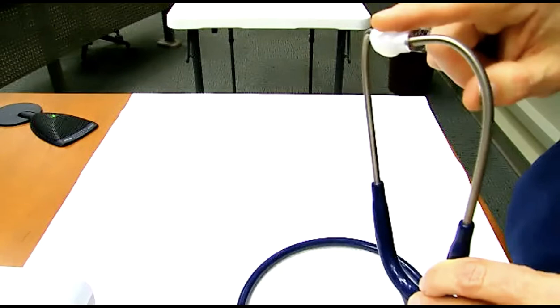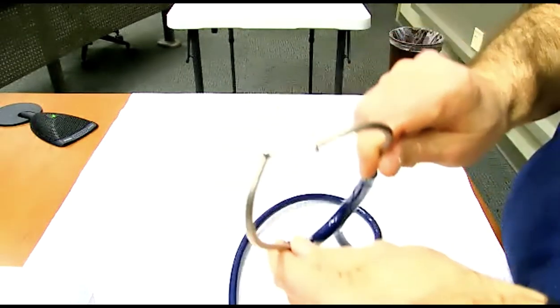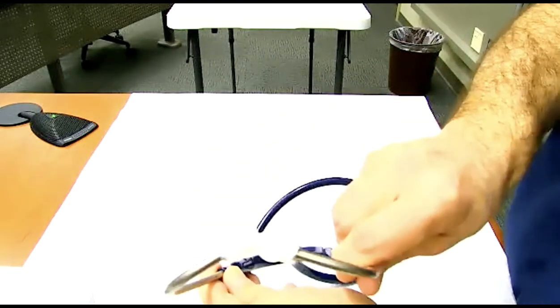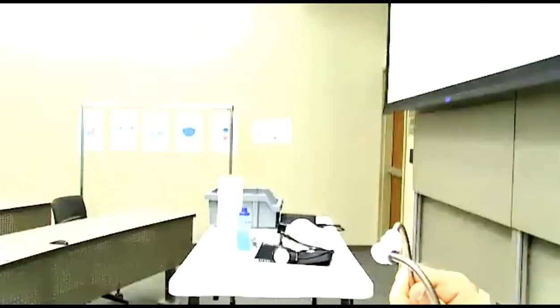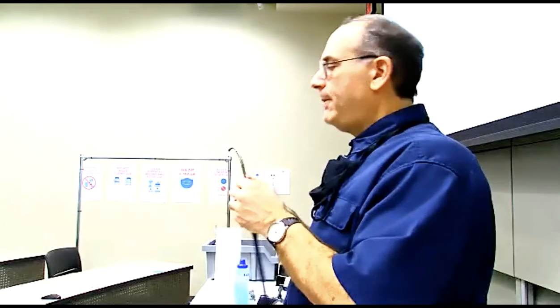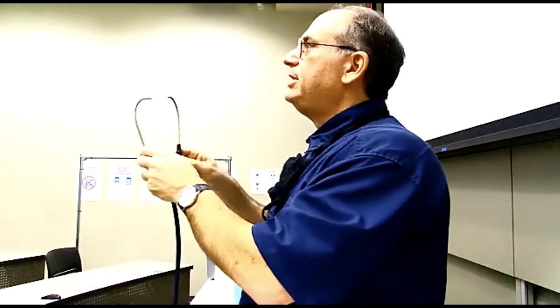Okay. But so you've got these earpieces here. Now, this is really important. Look at your things. When you put them together, do you notice that they don't come straight together, that they're at an angle? Here we go. I'm trying to show you they're at an angle. So when you go to put them in the ear, this is important. Maybe you can see this here. So if I put these in the ear, you can kind of see that they're angling towards my nose. It's a 15 degree angle. They don't go straight together, but they're angling 15 degrees at this point towards my nose. Or should I put the stethoscope around my ears?